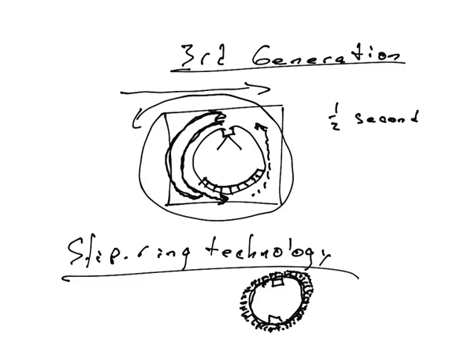But these filaments, even though they're touching the machine part of it, so it's supplying power, if it's touching, the circuit's complete, they're not connected to where they're locked into place. So you're basically just touching these wires without the wires being connected in.